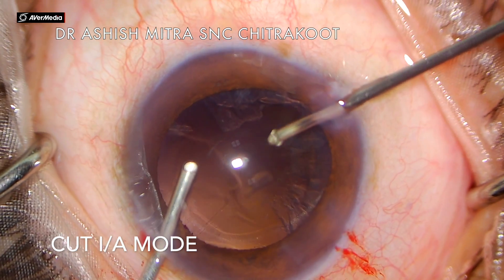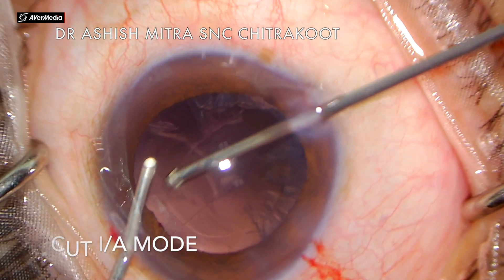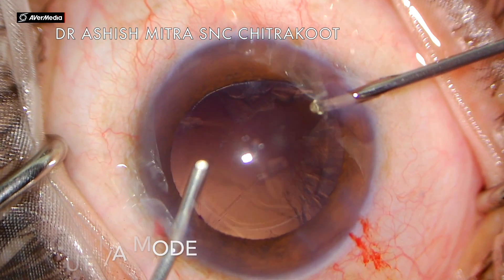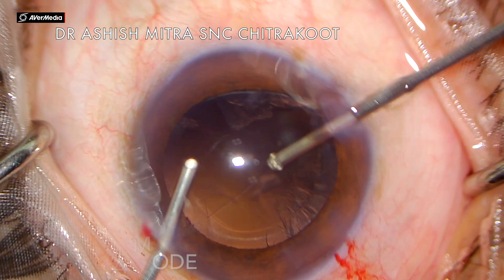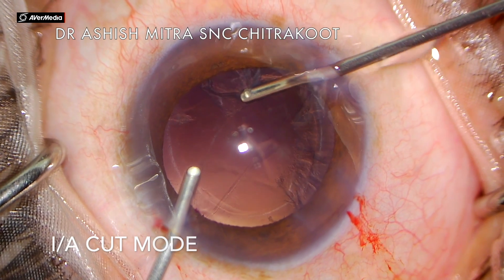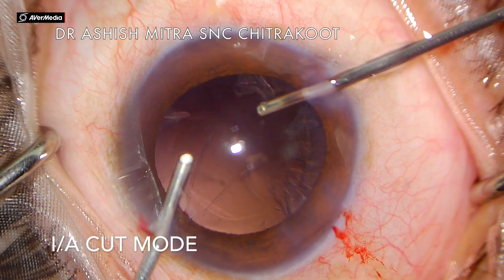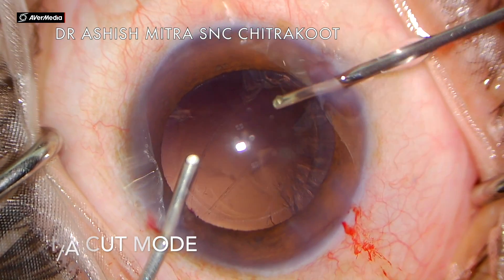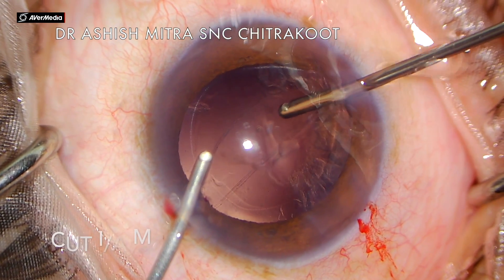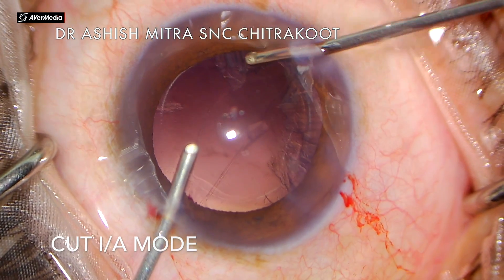If small nuclear fragments remain, removal can be attempted with the cutter set to 250–300 cuts per minute and increased vacuum. However, in this case there were no nuclear fragments — only thin cortical fibers — so I reduced my cut rate to 10, aspiration to 20, and vacuum to around 400.